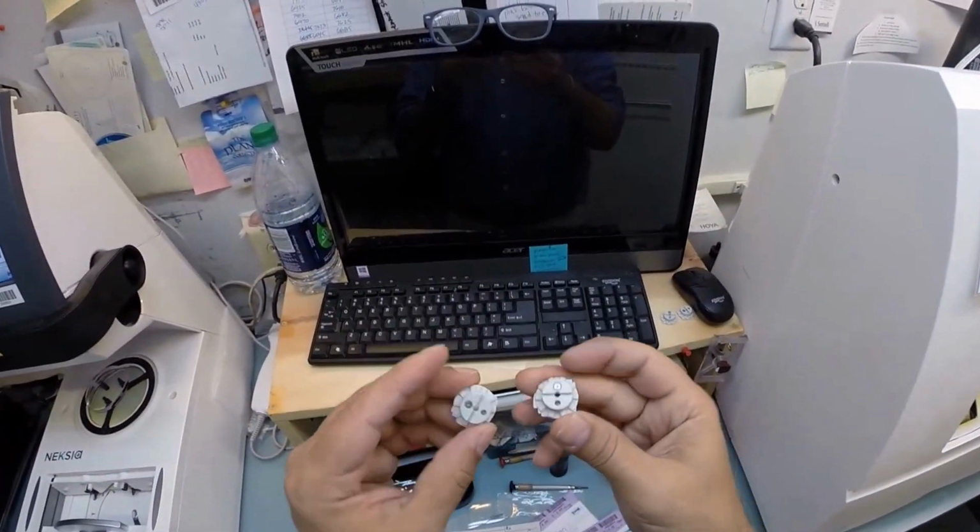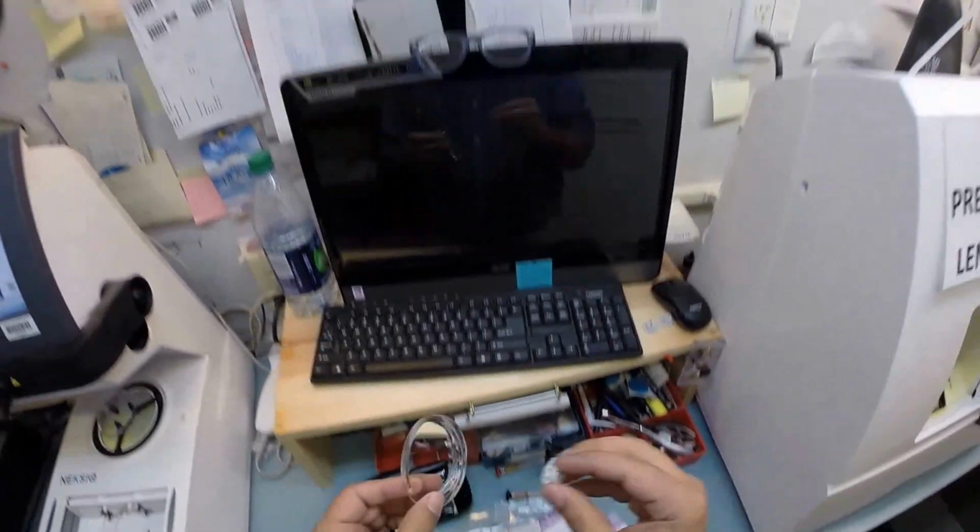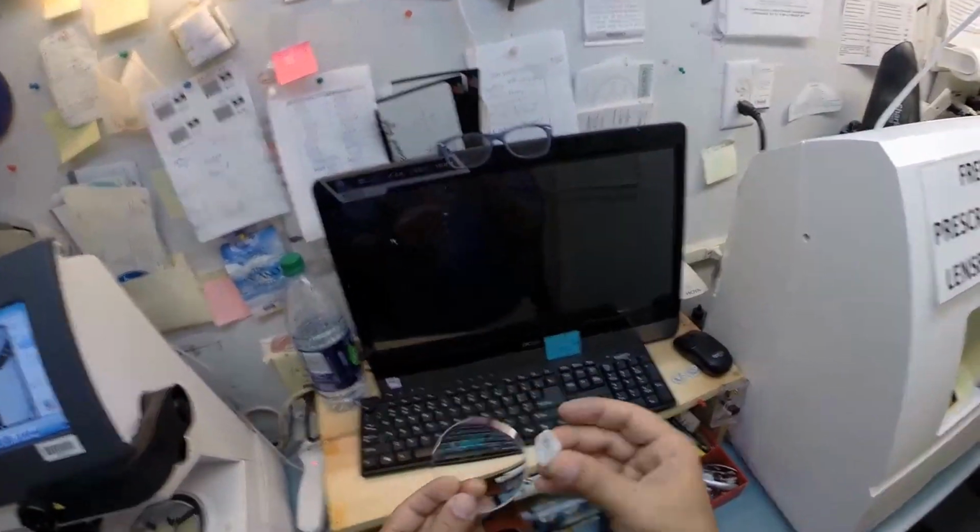Okay, let's come back down here. I'm going to take your right lens, put it on the platform. This is a block. I like to call him Jenny from the block. I need to attach this to your lens while it is cutting. This is what's going to hold it in place in the lathe.